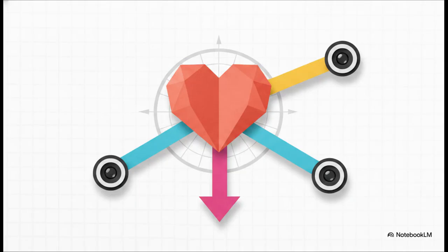And to measure that axis, we look at the specific angular positions of those frontal plane leads. It's all measured relative to the positive pole of lead I, which sits exactly at 0 degrees on our geometric map. From there, lead II sits perfectly at +60 degrees, and lead aVF points straight down from the bottom at +90 degrees. It's a ridiculously precise mapping system, literally no guesswork involved about where our cameras are set up.